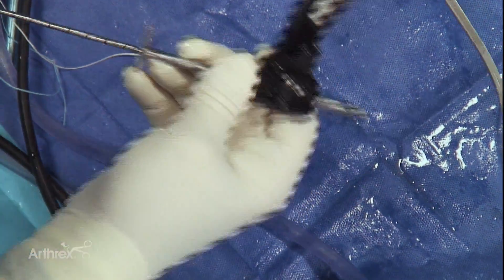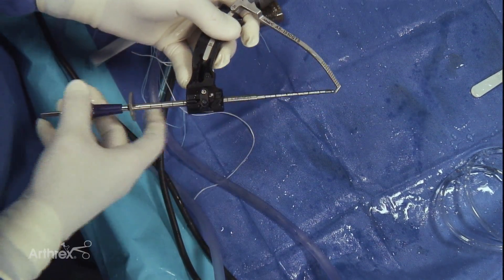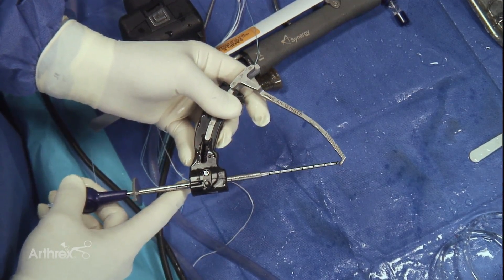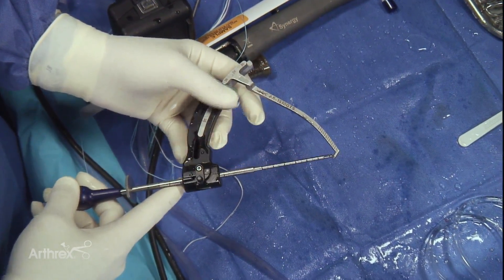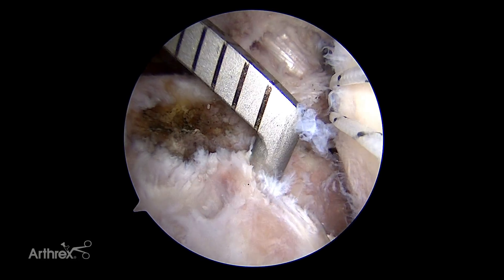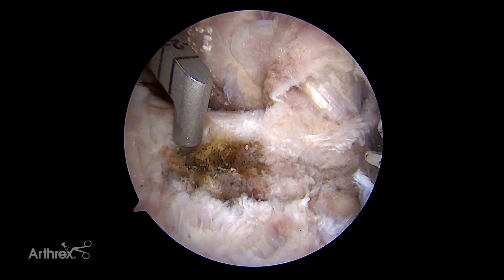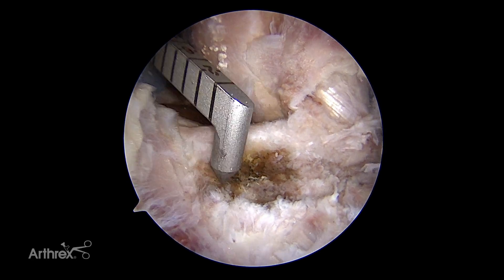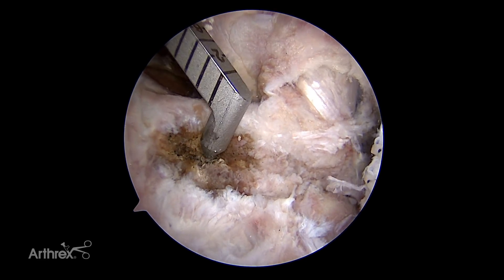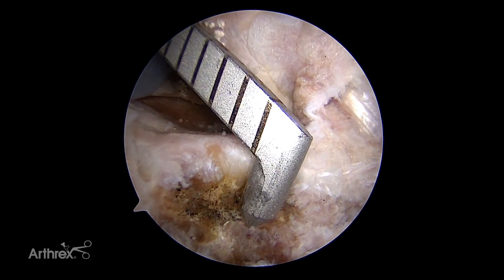The other feature on this particular system is that the flip cutter or guide pin will come out just prior to the tip of the pin — some of these guides have a so-called tip-to-tip positioning. We intentionally developed this such that the guide pin, or in this case the flip cutter, comes out behind that, or anterior to it on the tibia. The simple landmarks that I'm interested in: here's the posterior aspect of the anterior horn of the lateral meniscus, the anterior aspect of the lateral meniscus, the lateral component, the medial tibial eminence, and the PCL all the way back. I want to be relatively closer to the medial side in general than the lateral side to help with the obliquity, and I'd like to be coming out just about at the point where I'm making that indentation. I'll place the guide just posterior to that and aim for that position.